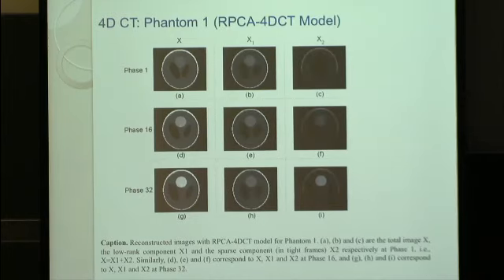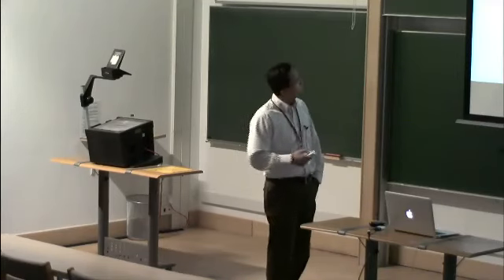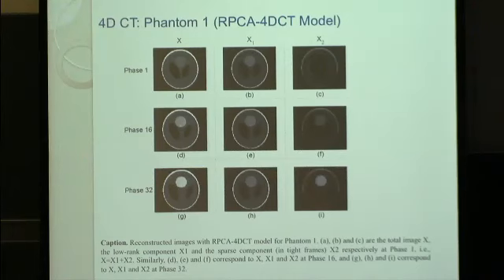And if we apply our model, of course, this decomposition is highly ill-posed. There are many ways you can decompose. You cannot get the perfect one, but you can already see this is our reconstruction. This is our denoised image. This is basically x1 plus x2. The noise is the difference between x1 plus x2 and the ground truth.